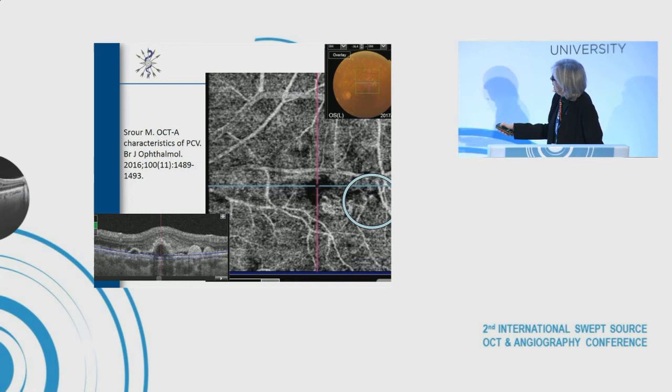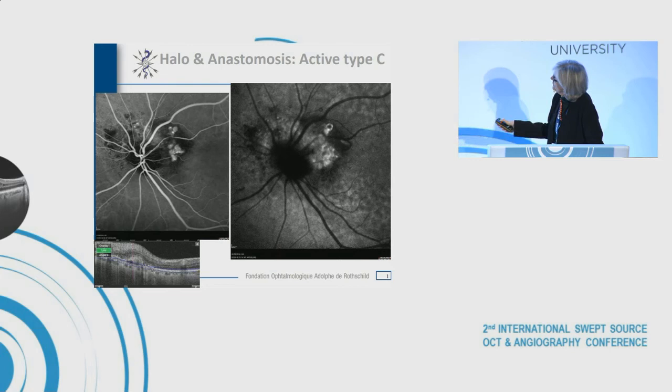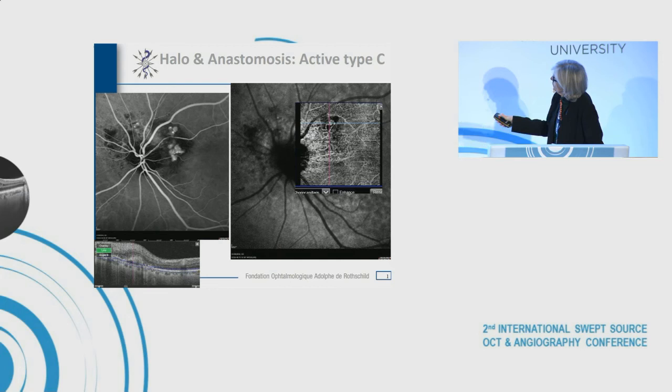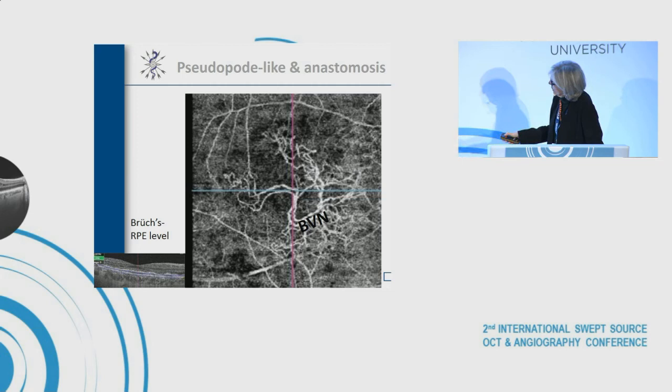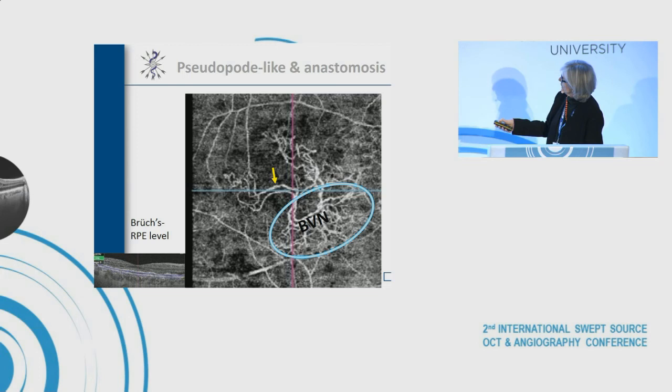Here, another case with active Type C PCV where the branching vascular network is quite dense. There is a kind of feeder vessel extruding from the branching, ending in a polyp or a kind of anastomosis. We often see this aspect of branching vascular network with a pseudopod extruding from the branching — this kind of extrusion from the branching vascular network, feeder vessels or anastomosis, ending in the polyps.